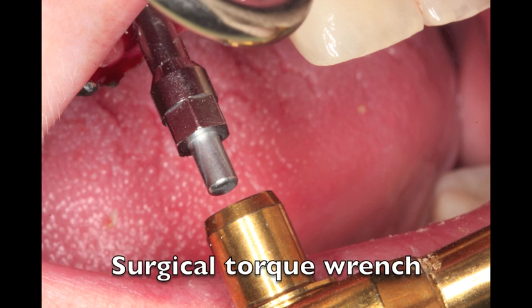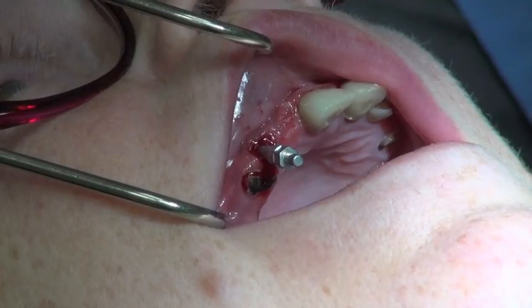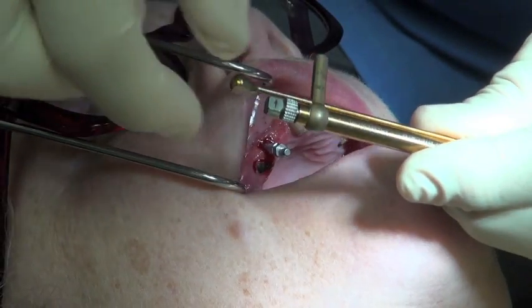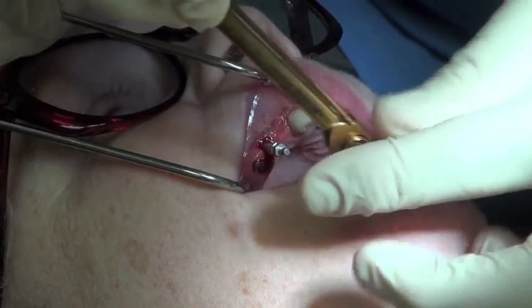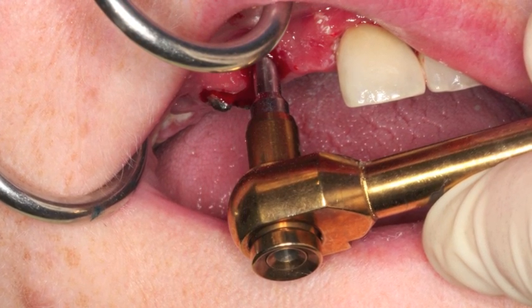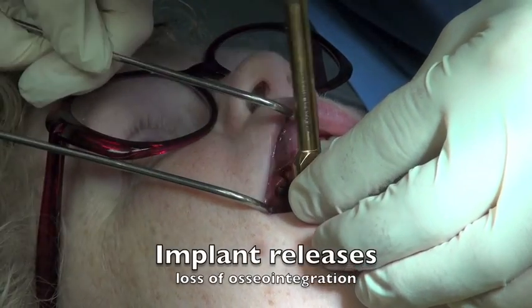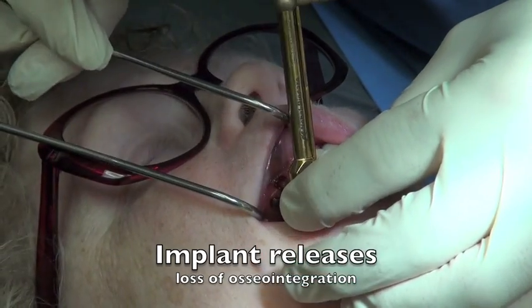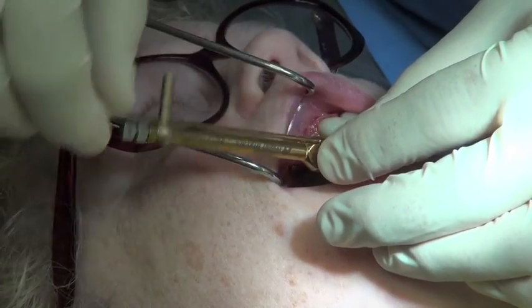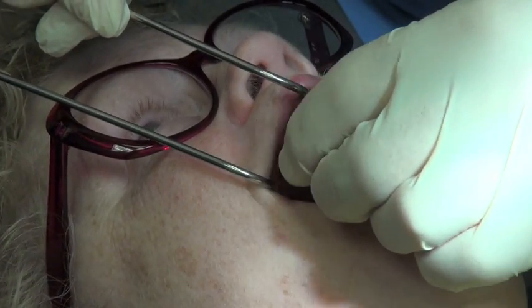Take your torque wrench and slide it down over this large hex, bypassing the connection. Many times the connection can be damaged or hooped — spread apart — but this goes right into the screw channel, into the core of the implant itself. Being in the core enables you to generate really high forces. Once the torque wrench is on, make sure the screw is going counter-clockwise. You can see it's releasing right there — the implant releases and we're able to unscrew it. Osseointegration has now been reversed and the implant screws out just as if you were removing it at the time of placement.